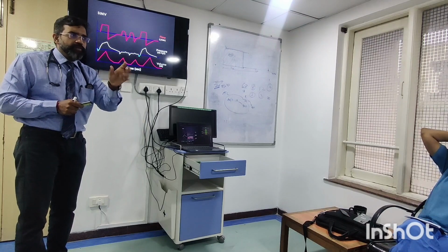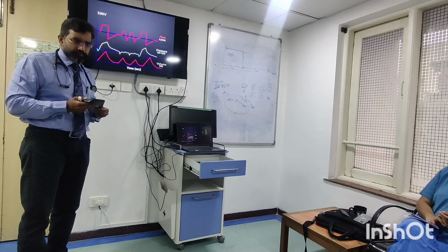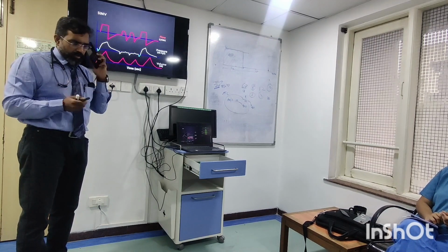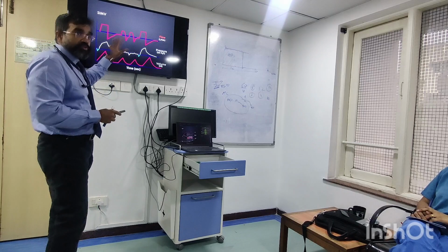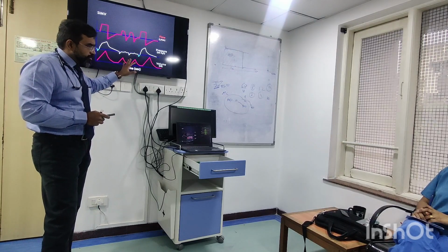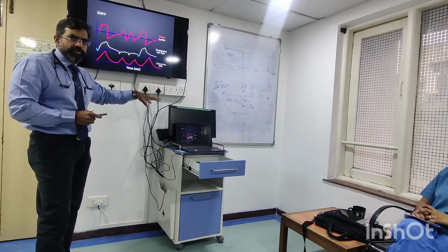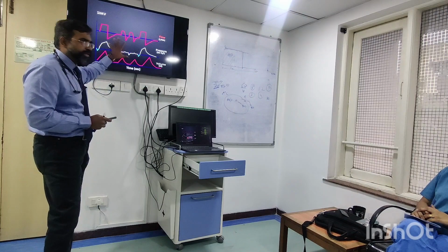That is the birth of SIMV. Clear? You understand now what's happening here? I have some pictures of what the early ventilators were, and also some history, which I can show you sometime later, but this you must understand.